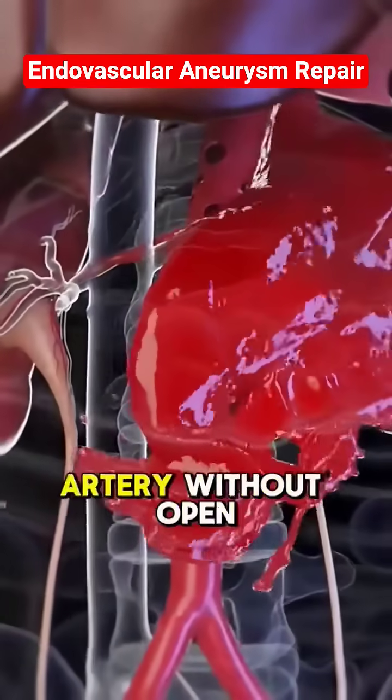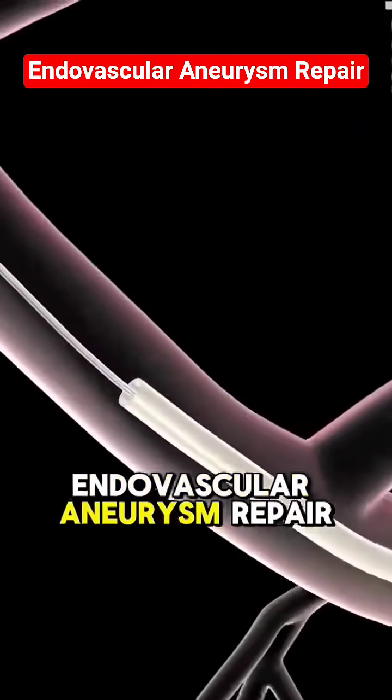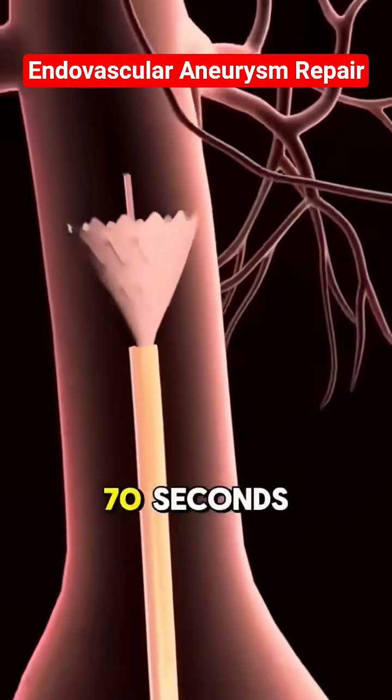Ever wondered how doctors fix a ballooning artery without open surgery? Let's talk about endovascular aneurysm repair, or EVAR, in 70 seconds.